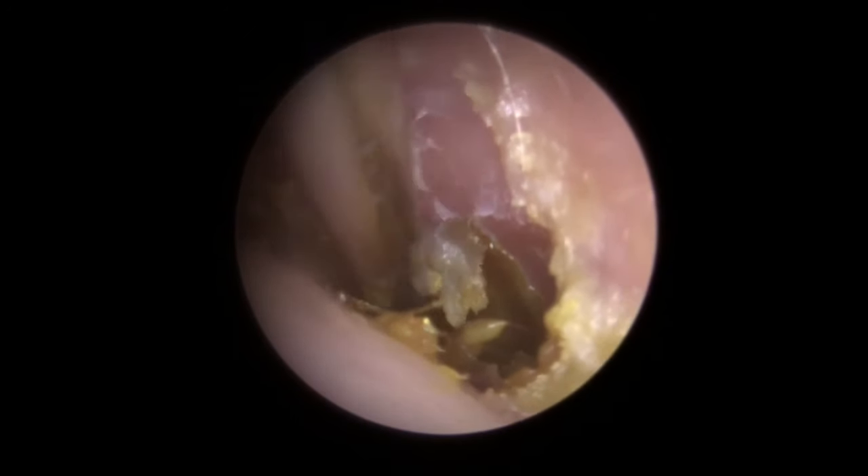I will warn you in advance — we don't get all of this away. I really, really try my hardest to get this top section away. What you'll see now with this top section is that when we get a grip on it and pull, we get a little tiny bit of a pull to the eardrum. Now it is quite loose — the top section is free. But the bottom portion is really, really firmly attached to the eardrum. The difficulty with peels like that is the eardrum's skin is less than paper thin — it's very, very thin. So if we pull too hard and it's too firmly attached, we're going to cause a tear.